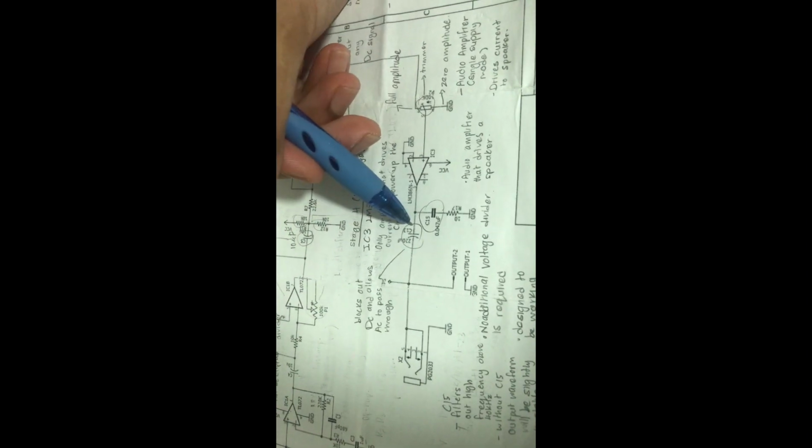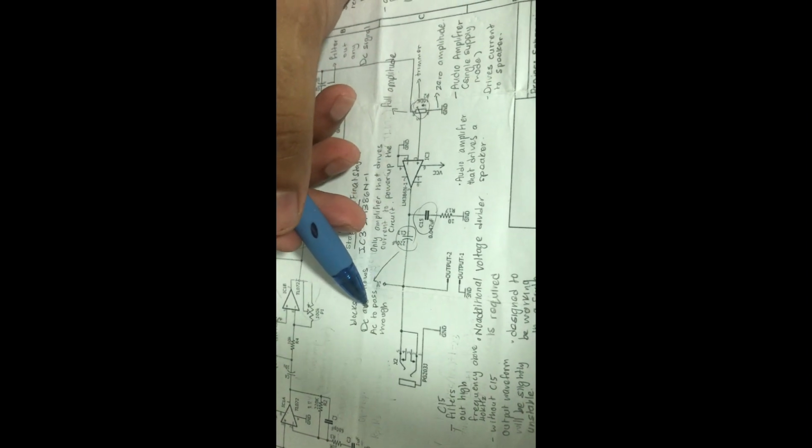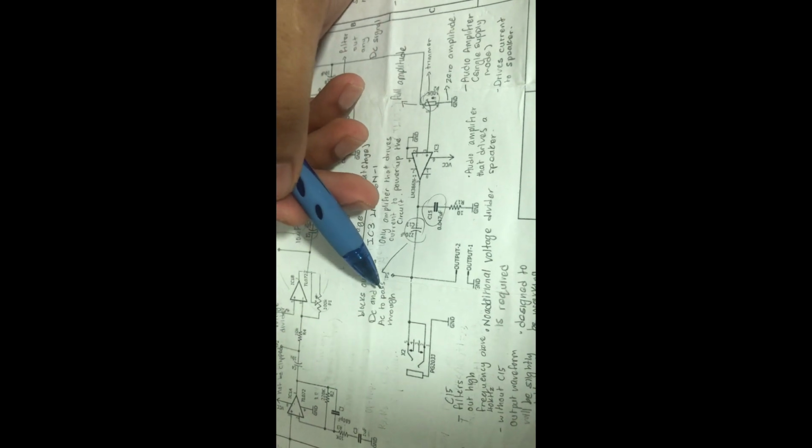So this is C13. It's a capacitor. This capacitor blocks out DC and allows AC to pass through as well. So in total, this is the only amplifier that is going to directly drive current to the speaker. So there will be no voltage divider required, and that's all for stage 4.